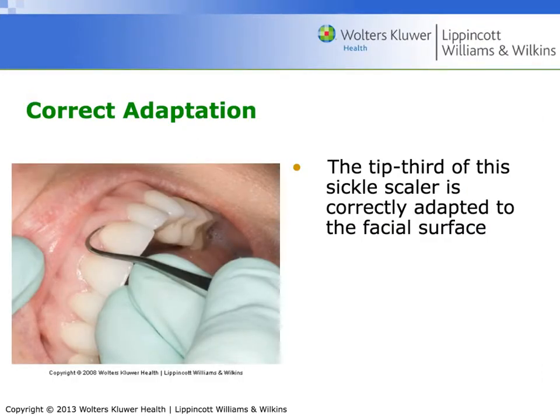This slide illustrates very nicely that the tip 1/3 of this sickle scaler is correctly adapted. As you can see here, the tip of the instrument is completely on that tooth surface. It is not touching the gingiva at all.